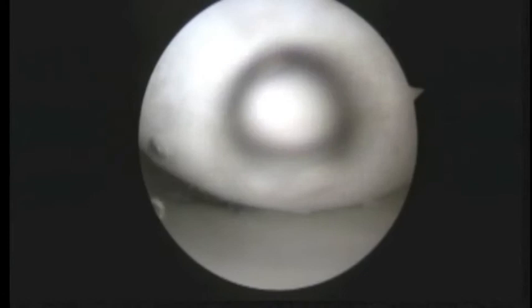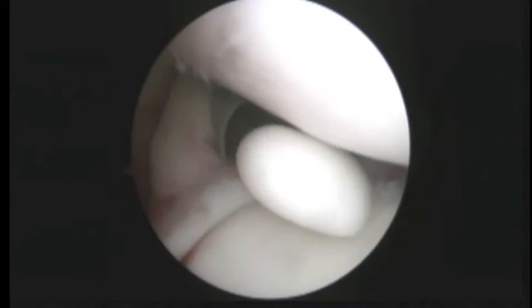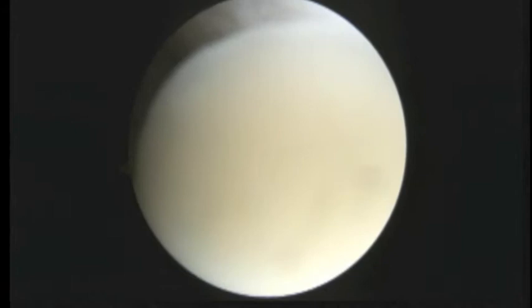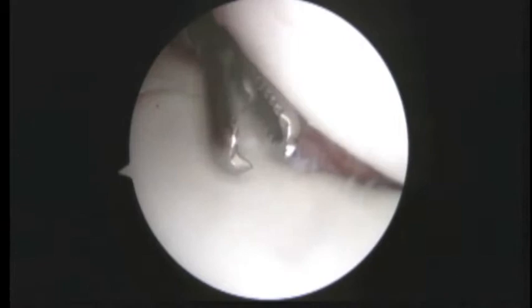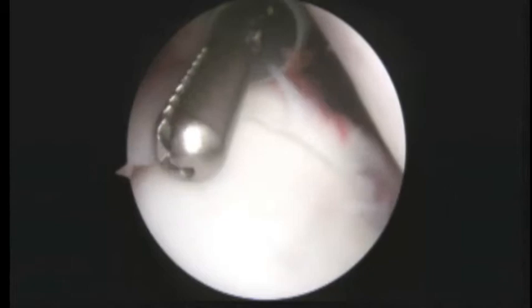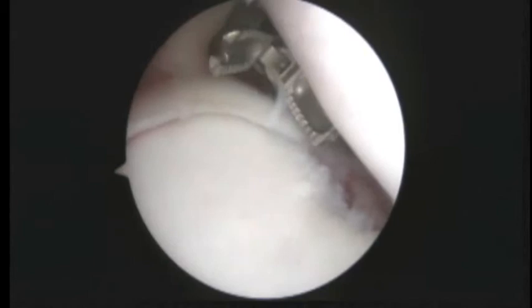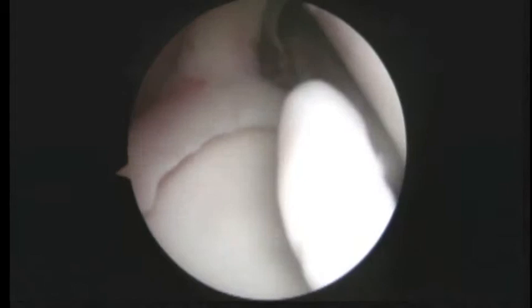We can see how even now it's kind of sitting out a little bit. There's a loose piece — we'll put it in the grasper and try to retrieve that. We're going to cut that piece and retrieve it here in just a minute.